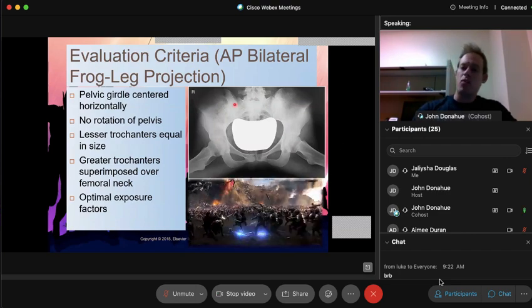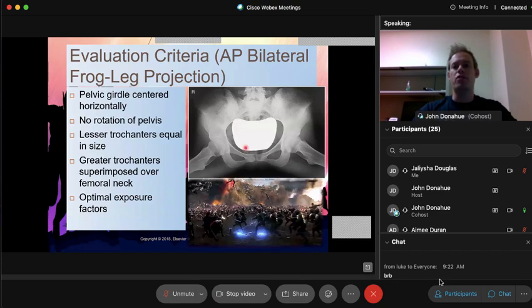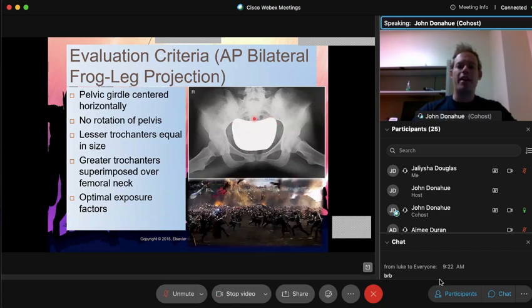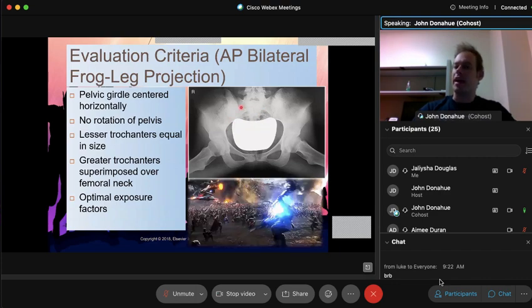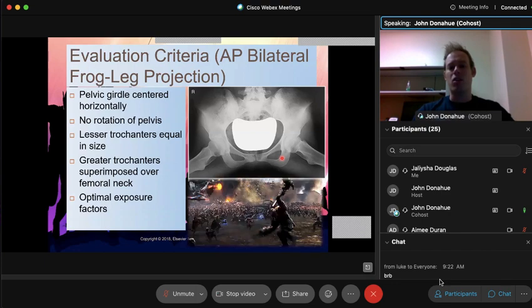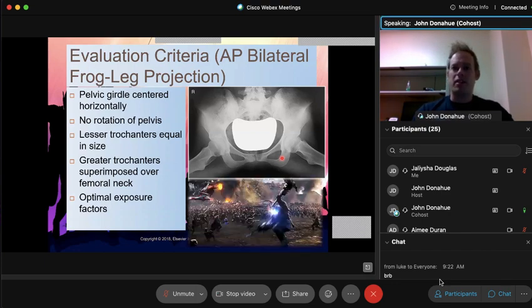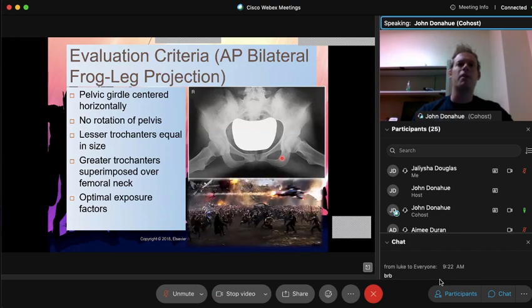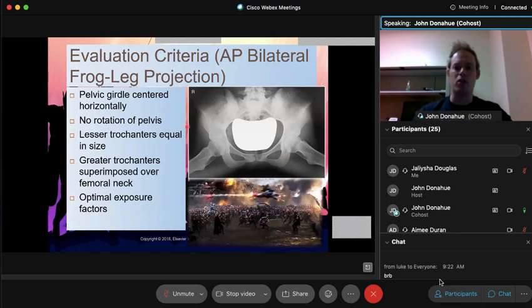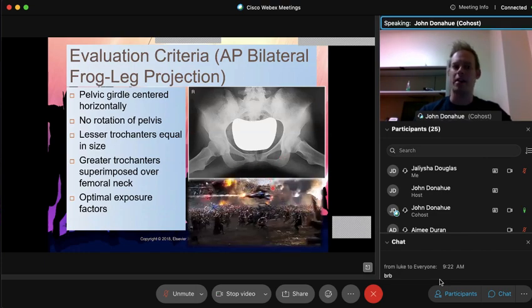And that's what it would look like, by the way, guys, if you were going to use a shield for a female. You want to put that shield right inside that pelvic brim like you see right here. If this was up higher and covering up parts of the pelvis, we'd have to repeat that x-ray. If it was too low, covering up the pubic symphysis, we'd have to repeat that x-ray. So, like I said before, it's very risky. I always encourage shielding. I mean, I'm very pro-shielding, but do keep in mind it's optional in females just because of the risk of going to repeat those films. Males, you can always put the shield well below the pubic symphysis. So it's not a risk of cutting off anatomy.